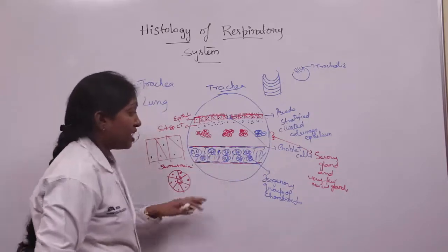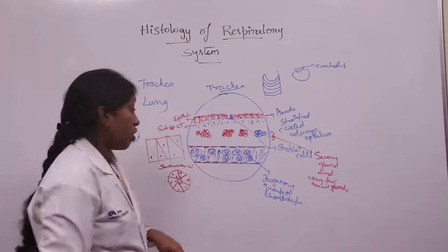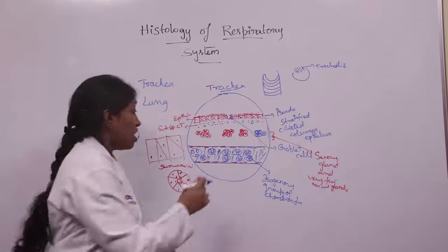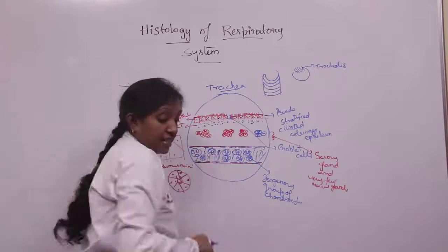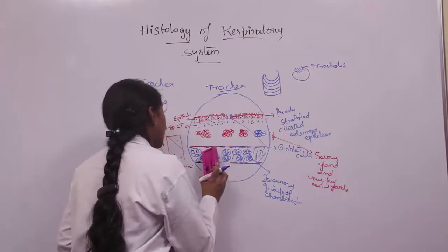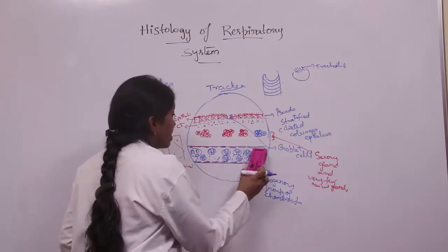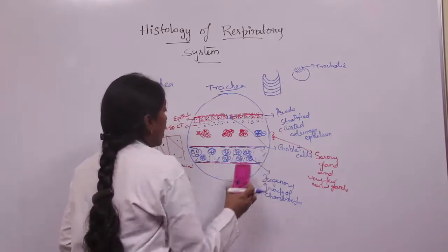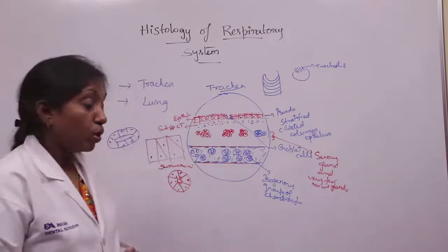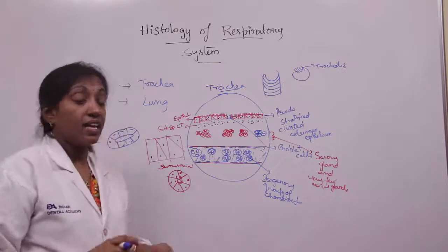And in the hyaline cartilage, we can't see the collagen fibers, because the refractive index of the matrix is the same as that of the collagen fibers. That way the hyaline cartilage looks translucent in appearance. A glass-like appearance is seen in the hyaline cartilage.